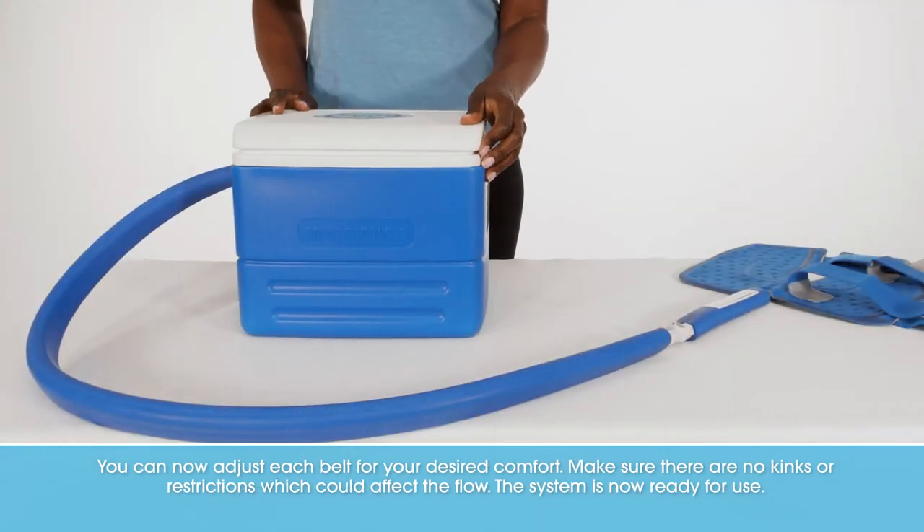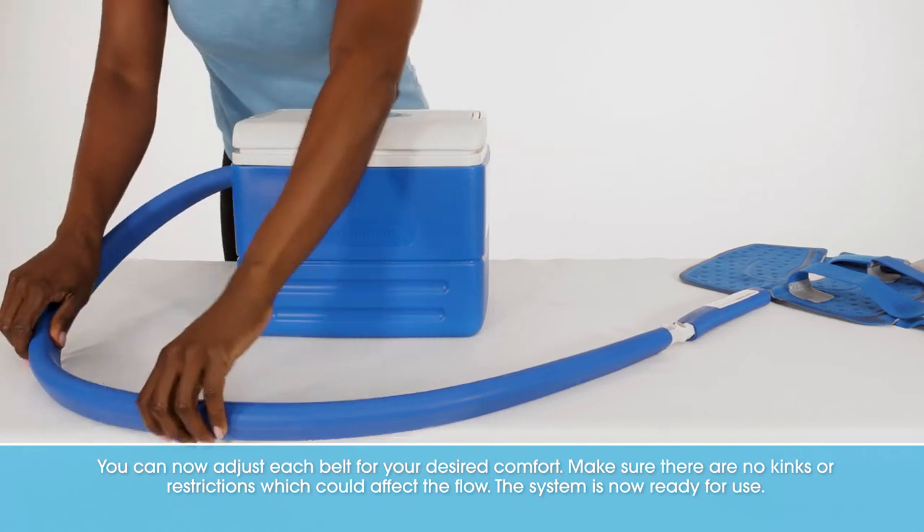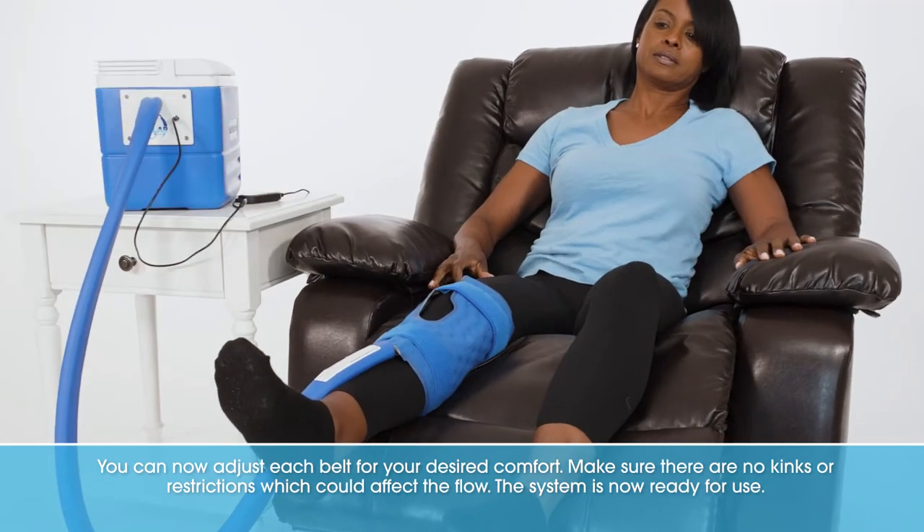You can now adjust each belt for your desired comfort. Make sure there are no kinks or restrictions which could affect the flow. The system is now ready for use.